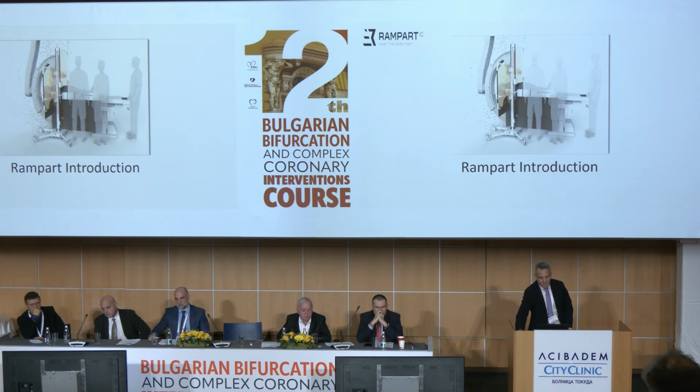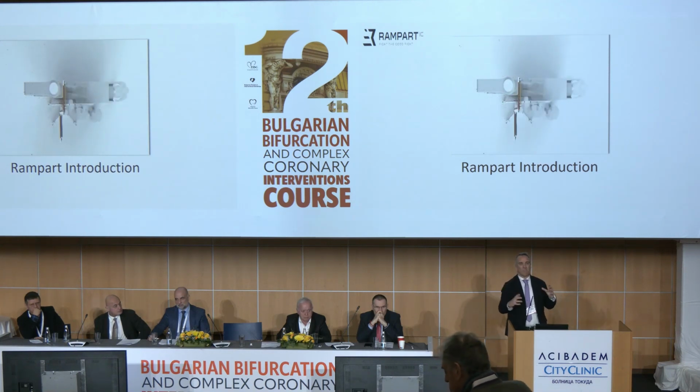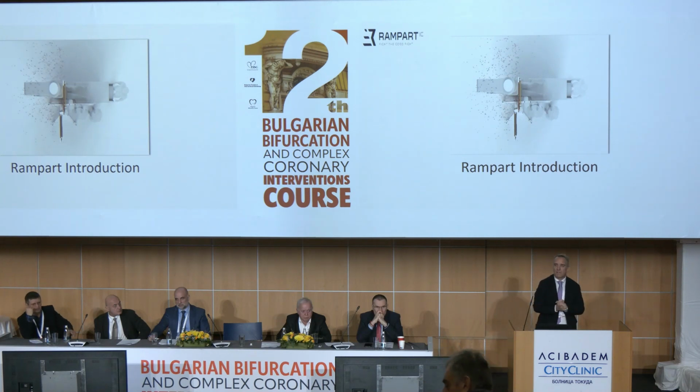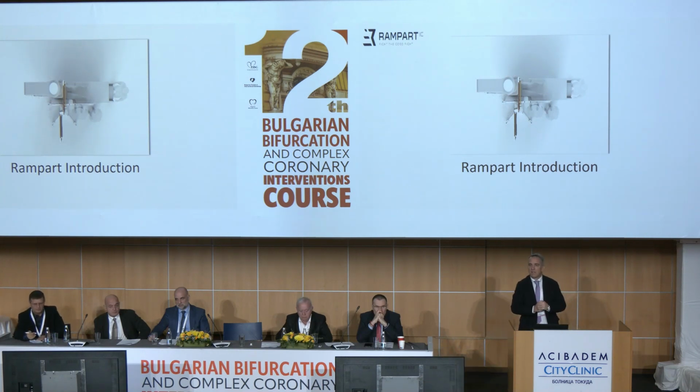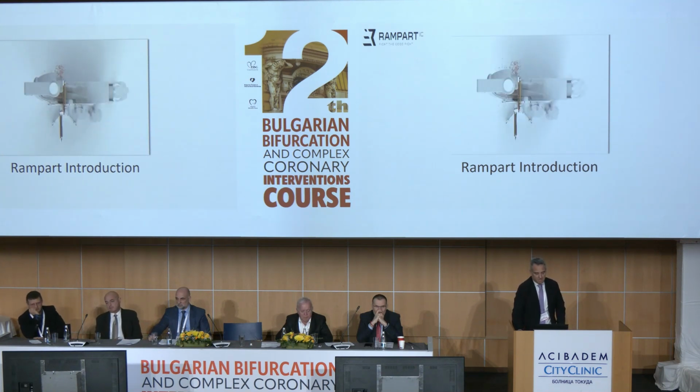The good thing is that it's a 2 centimeter plexi wall with an additional bismuth layer inside that is produced by just one company in the world, so that's why it's very expensive, but it does a good job in protecting the people who are working on the right side of the device.